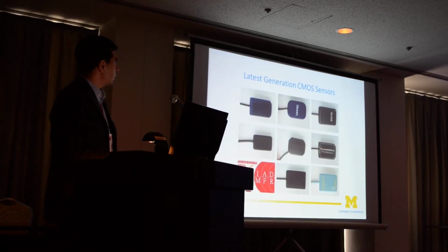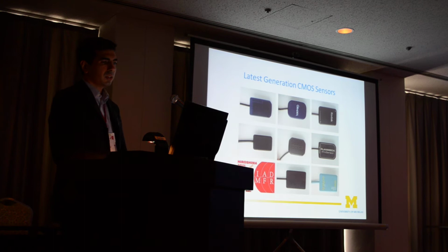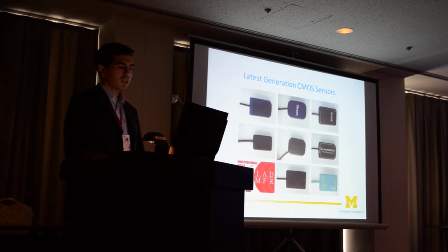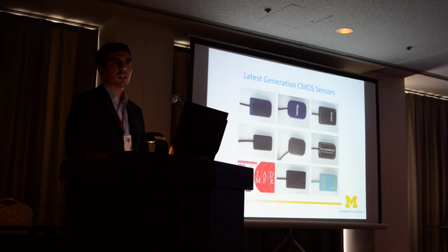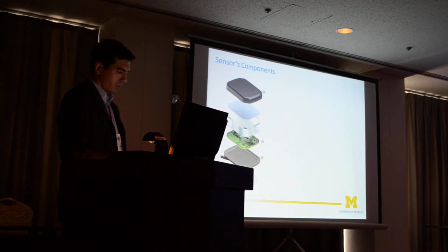I evaluated different latest generation CMOS sensors: the Sirona Xios, Gendex GX700, the Kodak 6100, also the Dexis Platinum, Planmeca ProSensor, XDR E2V, and the EVA Plus sensor, plus the Schick Elite. So I covered almost all the major sensors on the market.